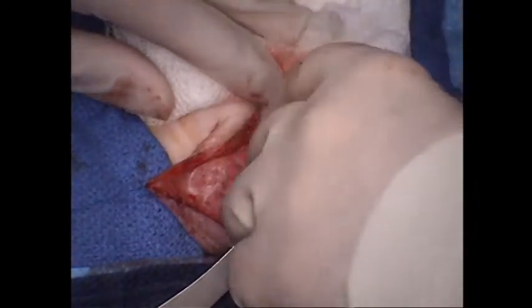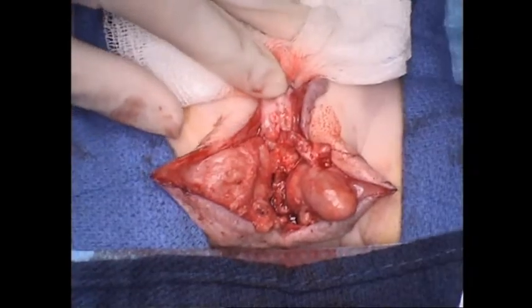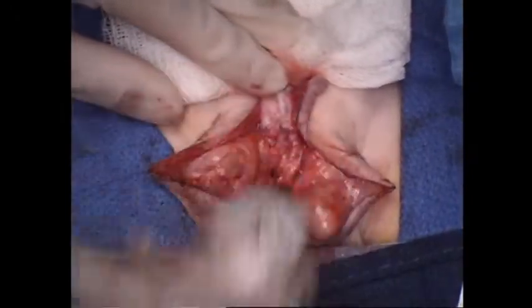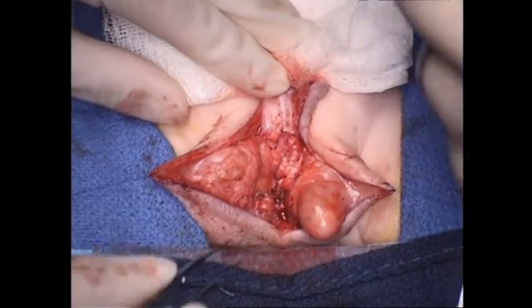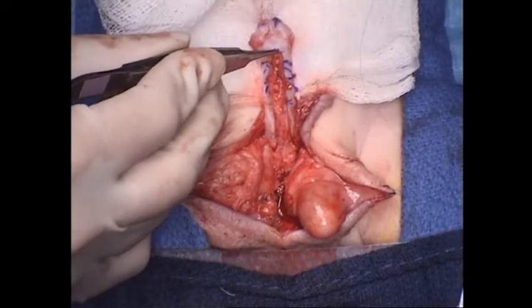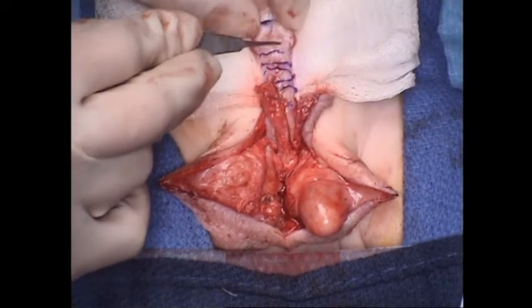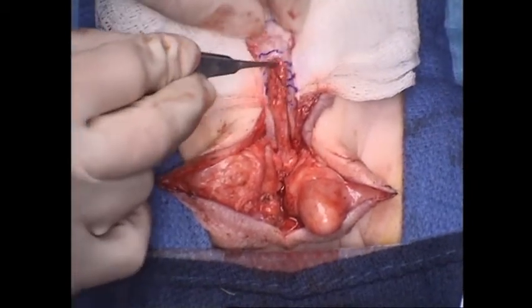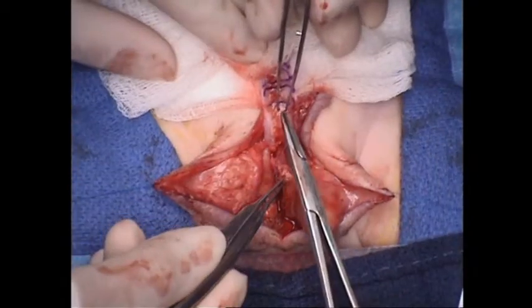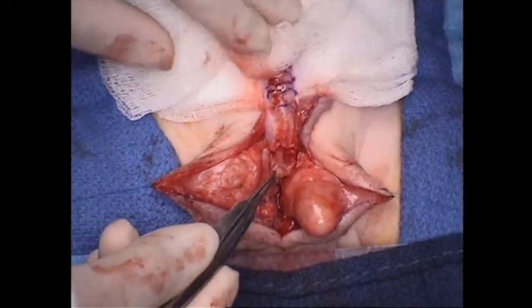We would like for the urethra to cover back over those corporotomies, and you saw before when she stretched it back out, it reached almost all the way to here. We're not going to take it to this top one. This is a little bit too small of an area to place a graft. So we're going to take it right here to give ourselves enough length on the graft. So we'll cover two of our three corporotomies.